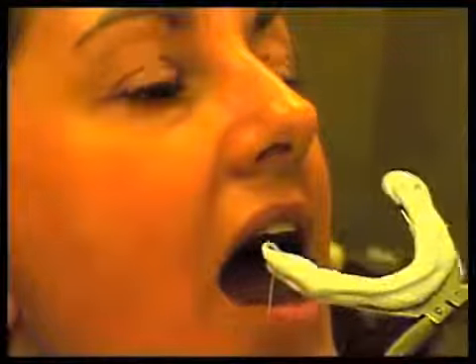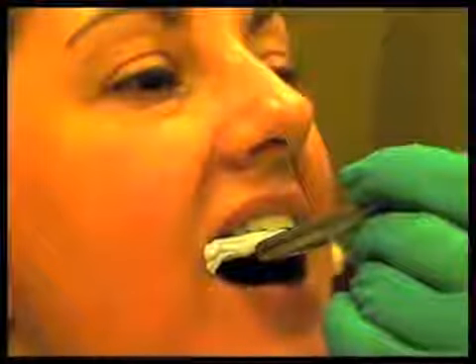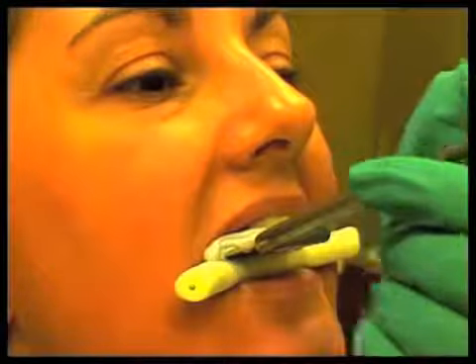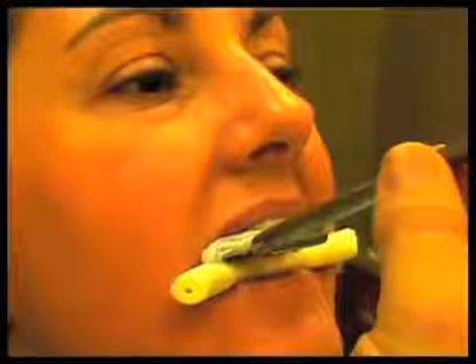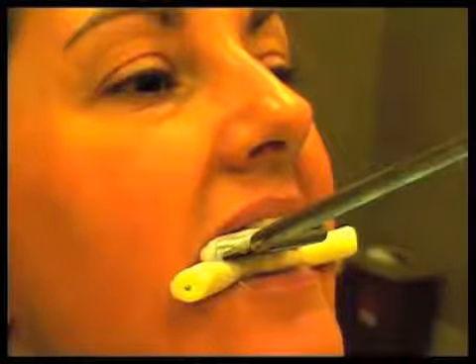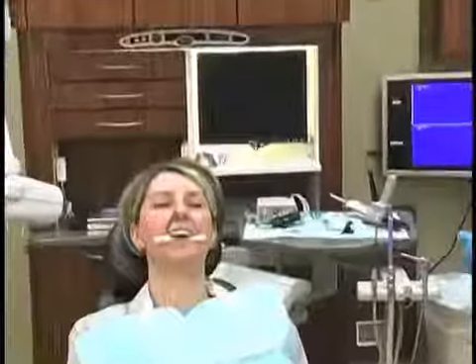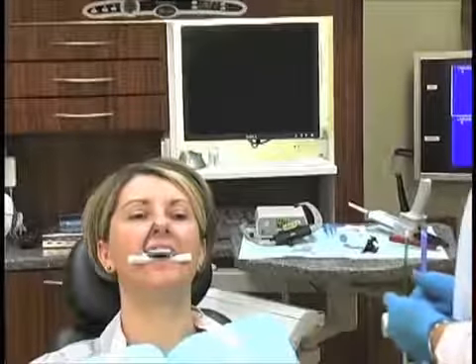All right. And what we're going to do is that little line on the Facebow is always going to be up. And we're going to go ahead and just seat it against her teeth and use a light bite fork or a large cotton roll to stabilize it. And what I like about this is, notice now this thing is pretty much on there. Once that gets nice and hard, there's only one place that fits. And here again, I've seen doctors trying to have the patient hold it there. And this is just a really simple way to get that part of this process done.